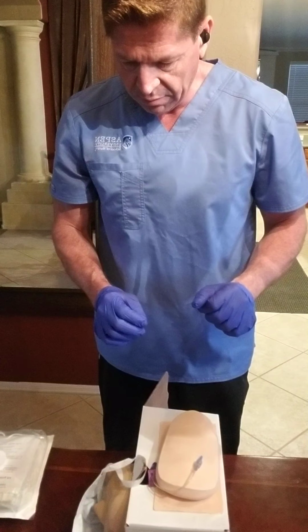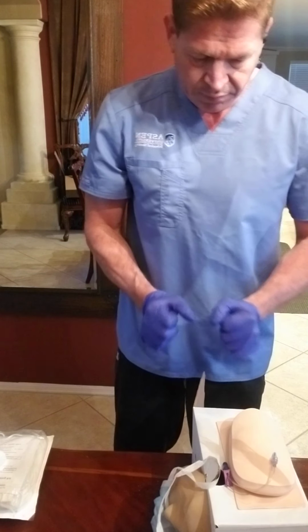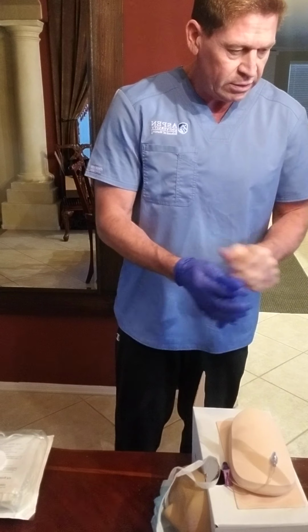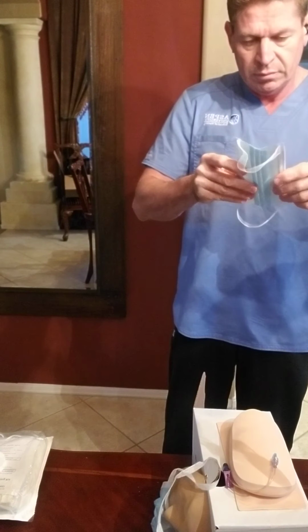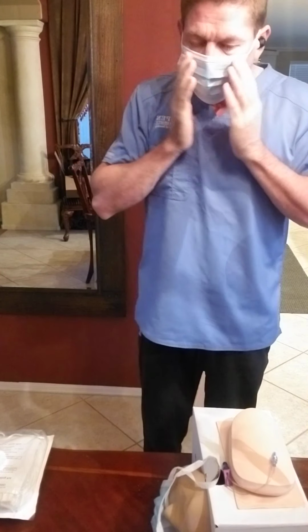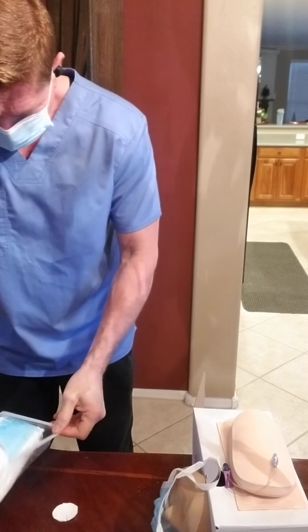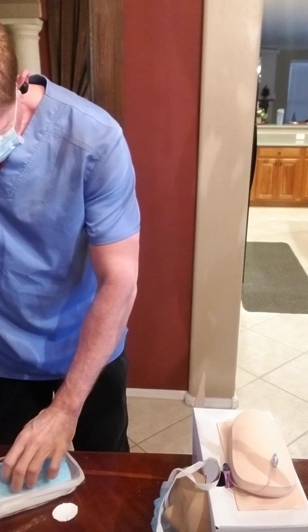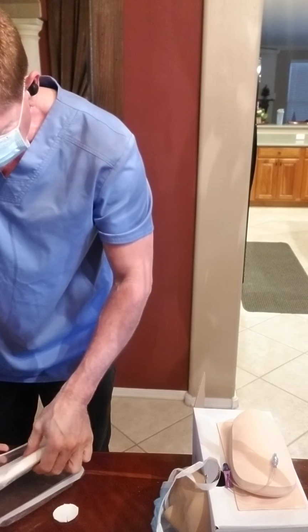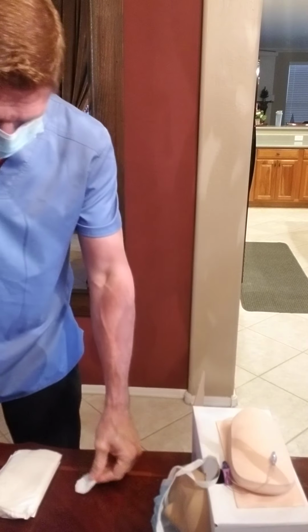Now that I've removed that, I have the patient on their side, then I am going to remove my gloves and do hand washing. Sorry, I should have had my mask to begin with. Then I'm gonna set the sterile field now. That was the mask for the patient. And then I have my kit here. This will be added to the kit as if it's sterile, because we don't have one in the kit.